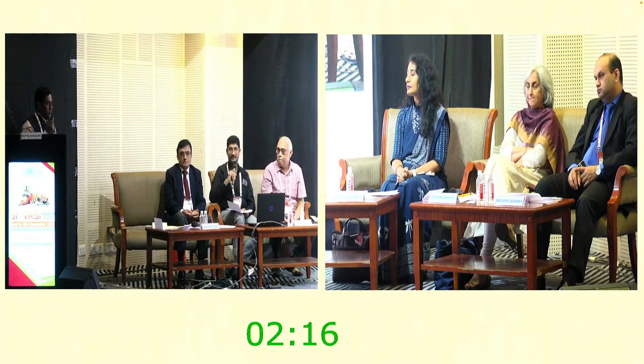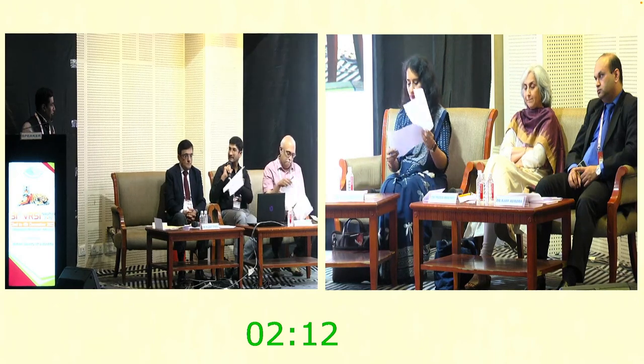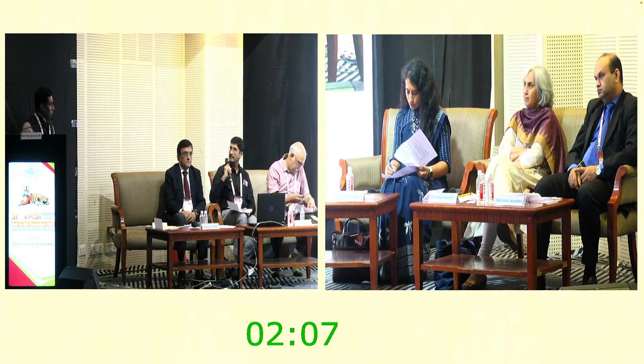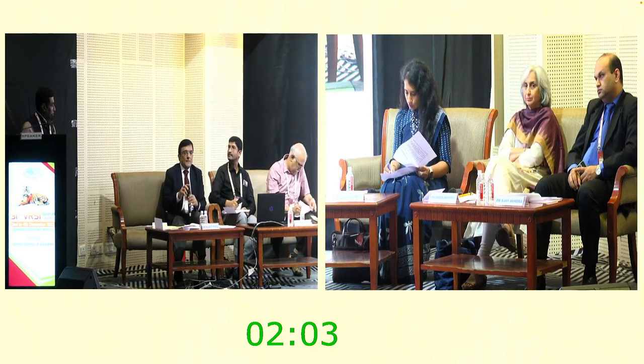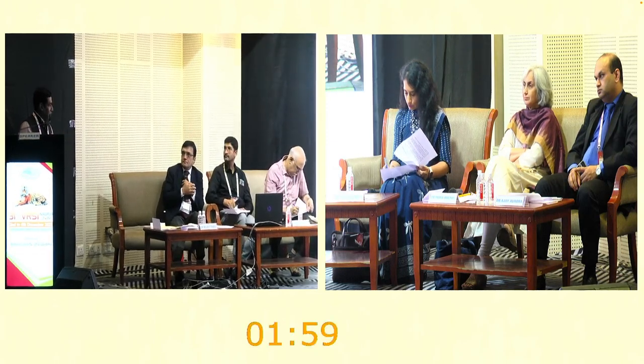Is there any guideline on an OCT if you measure the thickness? This is the range which is acceptable for a normal supracoroidal injection? We have not done OCT, but clinically we see the patient before getting it for the injection. And we have outlined the exclusion criteria too.